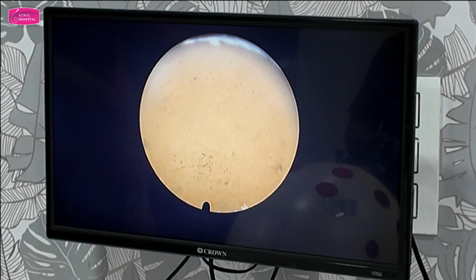Most of the times there is some blood inside the uterine cavity, some mucus inside the uterine cavity. So once you open the outlet, dirty fluid will come out and then normal saline will fill in the cavity. You can see the clear picture. Are you convinced with that? Yes. So I most of the time suggest my fellows not to purchase only diagnostic sheath. Why to purchase unnecessarily if you are not going to use it?